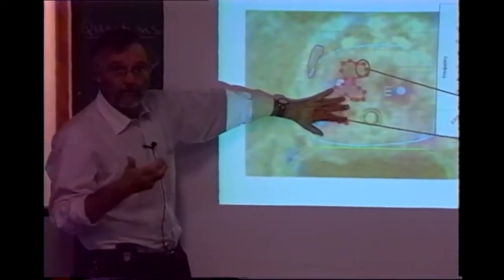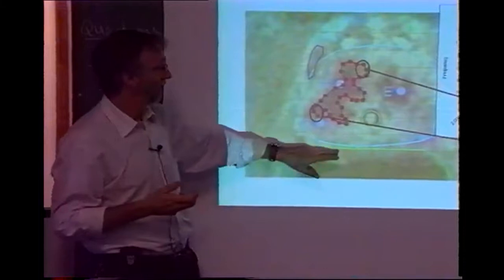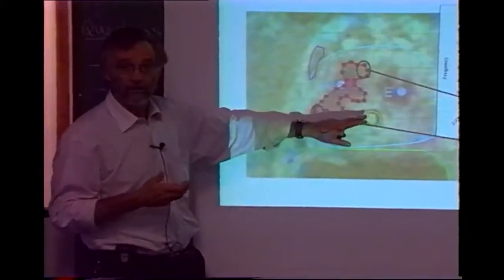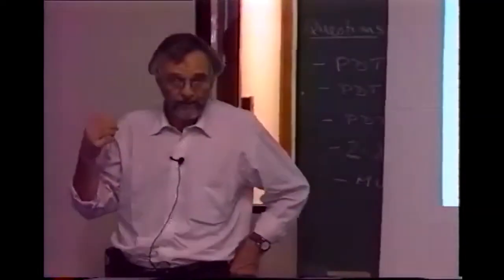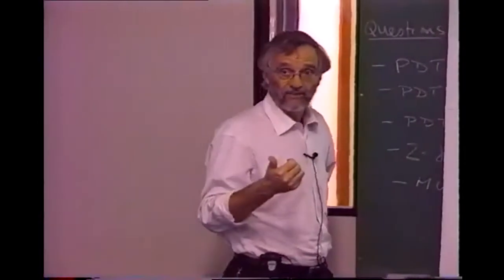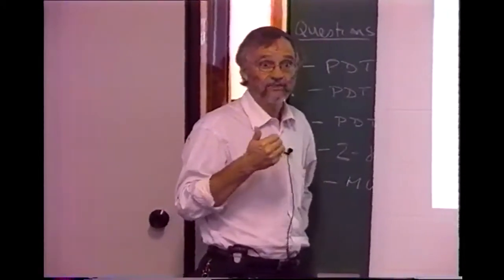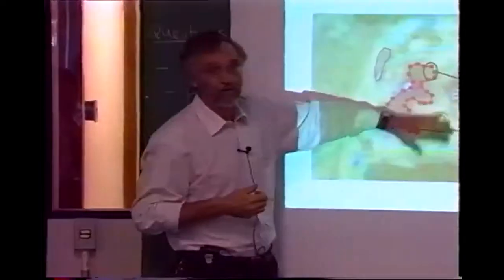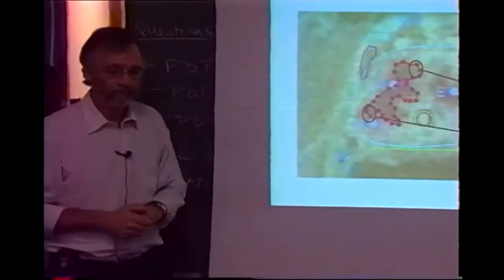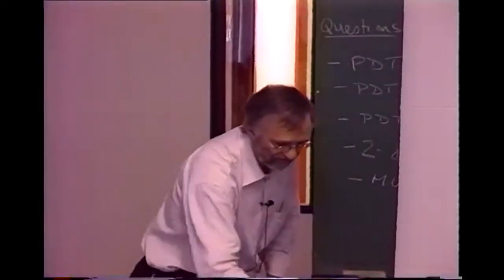So you have to be very aggressive, but you have the rectum close by, you have the urethra, you have the bladder sphincter, you have the erectile nerve bundles, so there are a lot of normal structures that you can damage here. So this requires very, very detailed treatment planning and measurement. Fortunately, most treatments are much simpler than that.